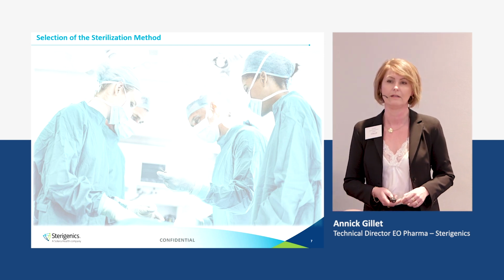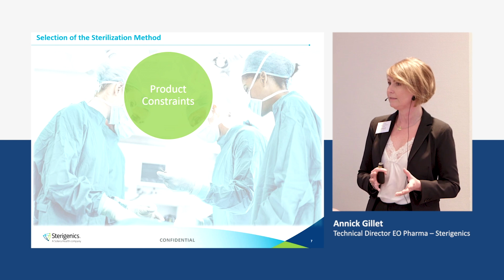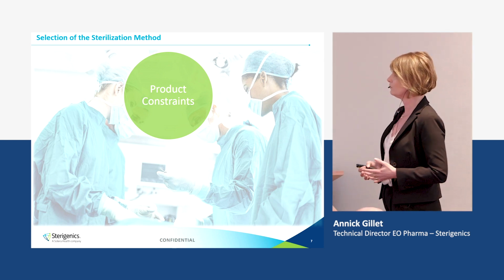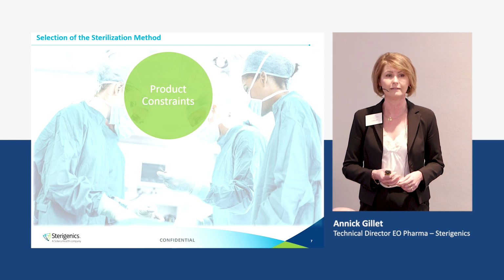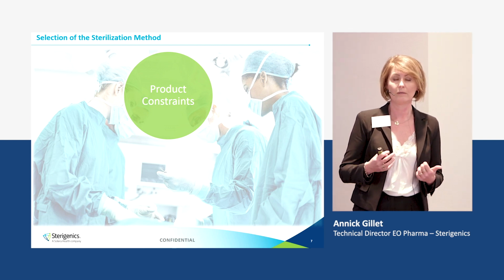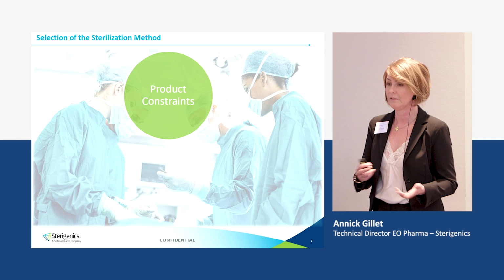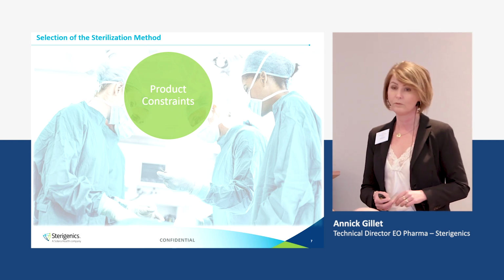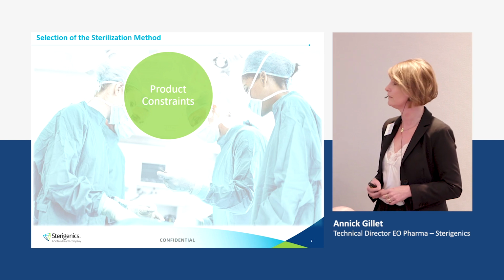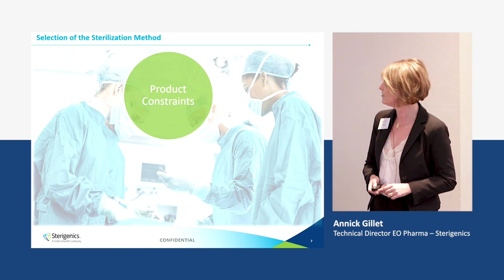How do you select your sterilization method? Three things to consider. The first one, and that's really the first element to take into account, is product constraints. So we talk with you to identify the constraints of your specific product. For example, can you accommodate high temperature? Till which level? Can the product resist humidity, yes or no? Can the product be exposed to radiation, yes or no? What kind of effect do you have if you expose them to certain doses, etc.? These are really important things to identify when you start a sterilization project.